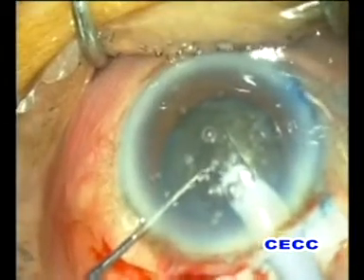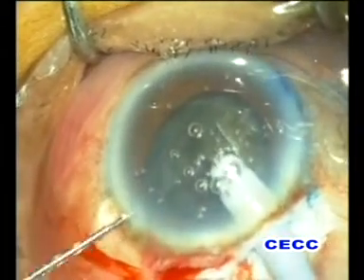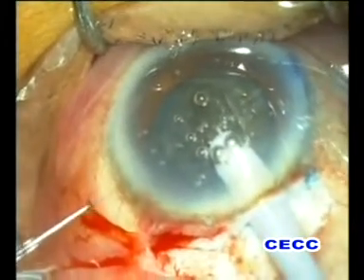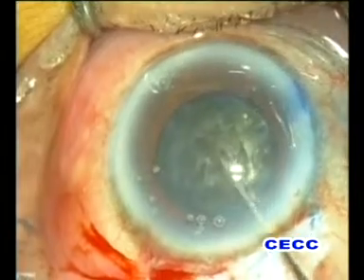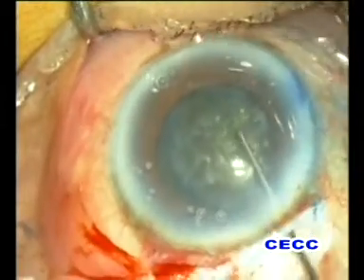In the meantime, the pupil was found to peak towards the paracentesis site and a block of viscous material was also seen. Presence of vitreous was confirmed by sweeping across the pupillary margin using the Sinski hook. We were therefore forced to decide on an alternative and safe line of management for the nucleus.